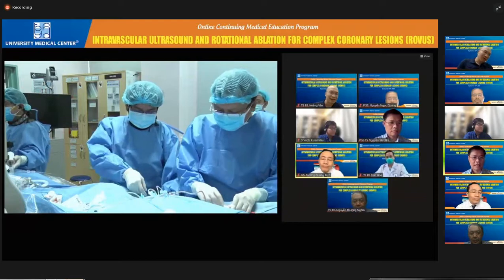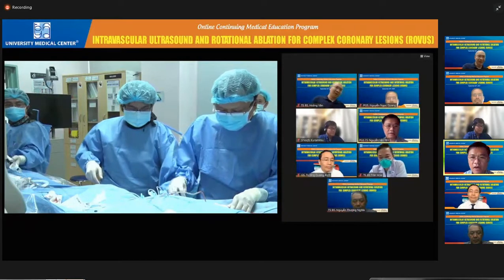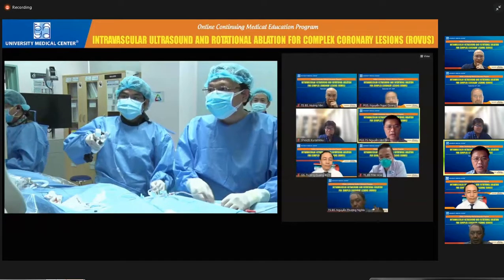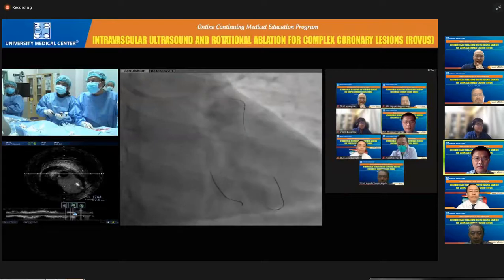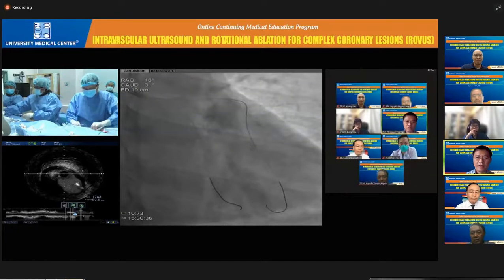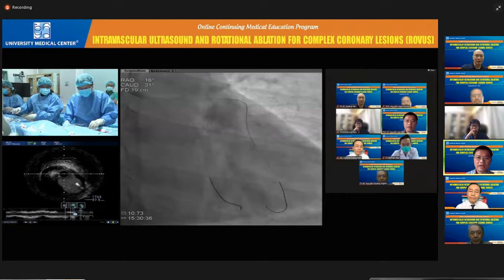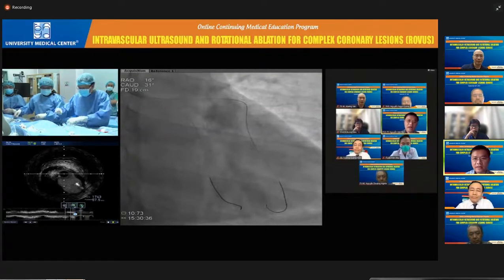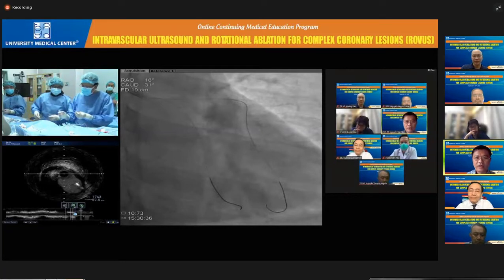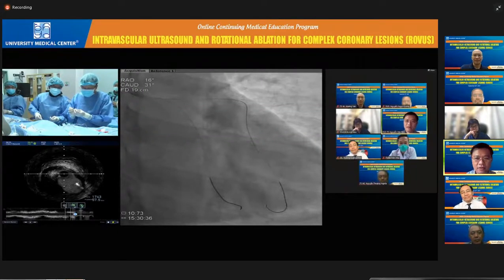Yes, I agree with your comments very much. Up to now, Dr. Vũ has IVUS, so the reasoning is very clear. In this situation, it depends on the procedure and on Dr. Vũ's experience. We have the two-stent DK crush strategy, and the other one, the provisional stenting strategy. Then after stenting from the left main to the LAD, we evaluate the ostium of the LCx, and we can stent with a modified technique or something like that. I think so.